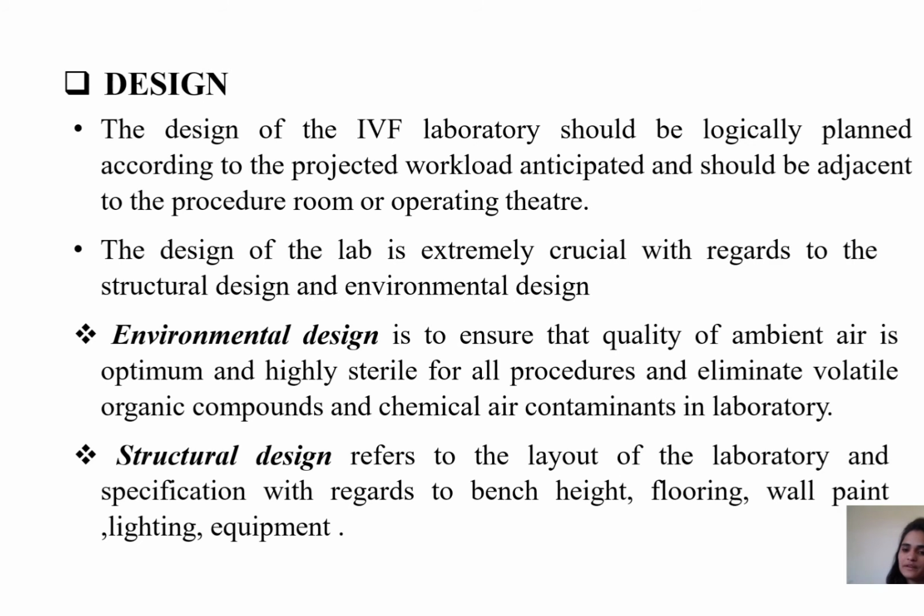Design. The design of the laboratory should be logically planned according to the projected workload anticipated, and should be adjacent to the procedure room or operating theater. The design of the laboratory is extremely crucial with regards to structural design and environmental design. In environmental design, it is to ensure that the quality of ambient air is optimum and highly sterile for all procedures and eliminate volatile organic compounds and chemical air contaminants in the laboratory. The structural design refers to the layout of the laboratory for specification with regards to bench, height, flooring, lighting, equipment.